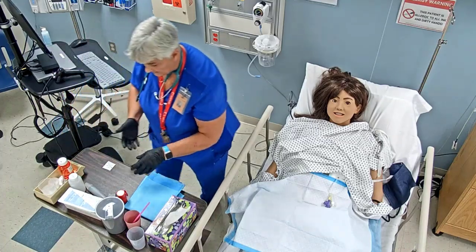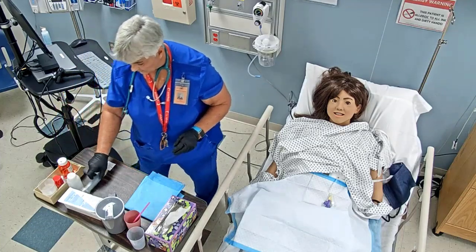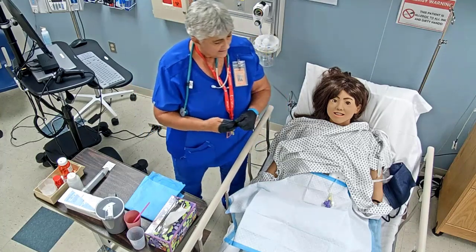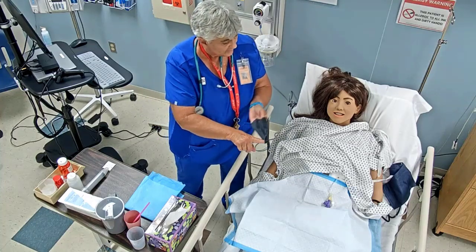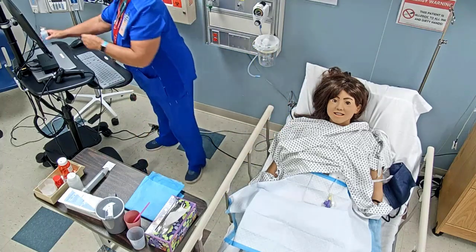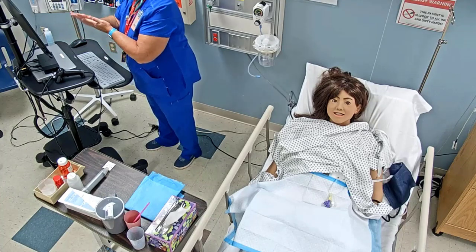We'll pour all of that in there. We'll get that clean so the next person can use it. We're going to be using that here. So now we're going to leave your head up for an hour, okay? And then if we need to, we'll check the orders to see if we need to hook up your enteral feeding again if you had it going to begin with. I changed my gloves and I didn't clean up, so let me clean you up real quick.